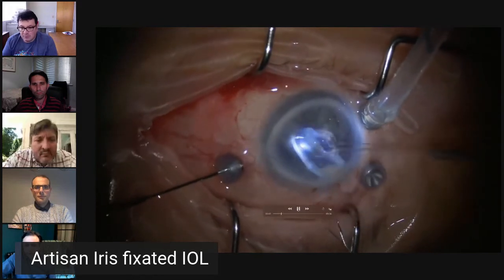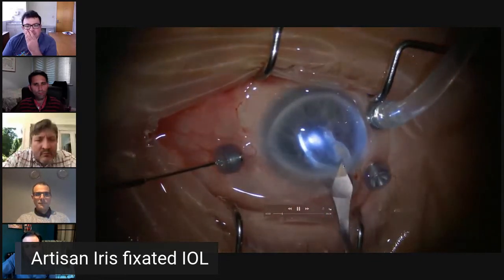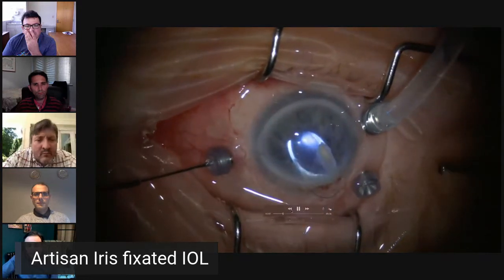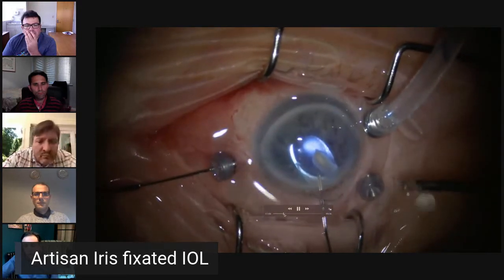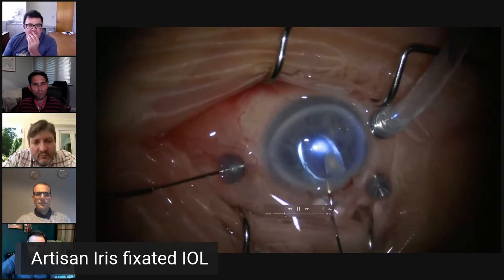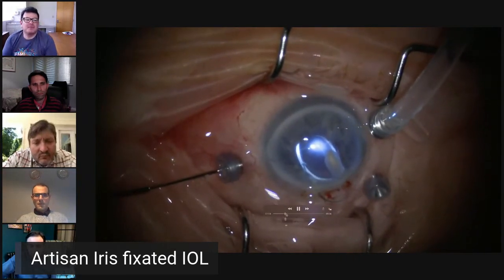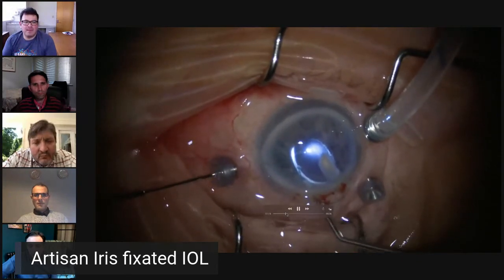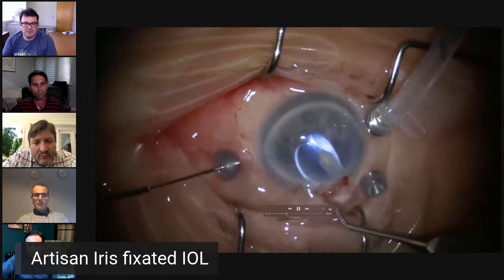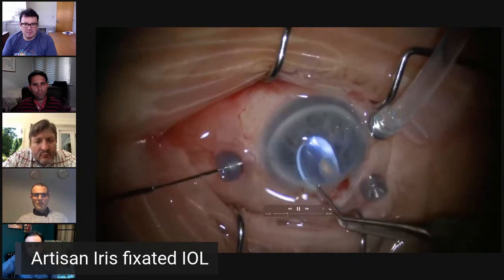And basically I externalize one haptic, enlarge the wound again. You see, it is very important to enlarge the wound, to make our lives easy. And you can see now the lens, always remember to put Healon on. You don't want to be doing a lot of manipulation in the anterior chamber. Also make space to be able to maneuver safely. And we're just going now to remove the lens.